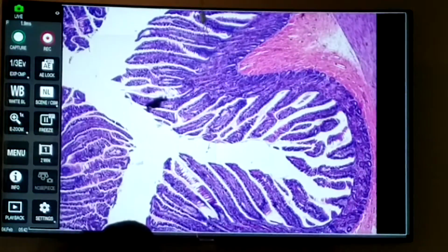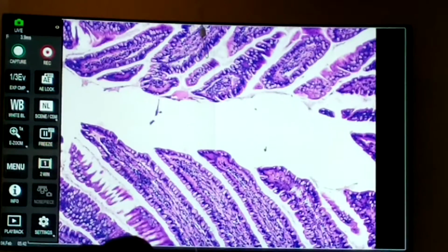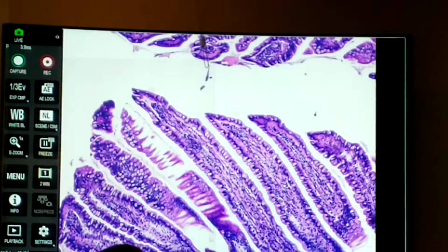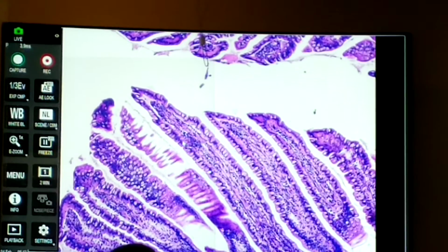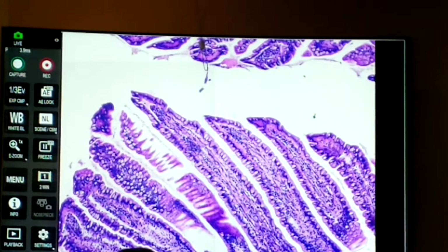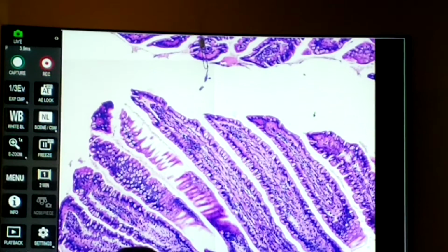Now, sometimes when you're looking at simple columnar epithelia, if you don't look at enough of the slide, some of the cells will be packed upon each other, and you can begin to look at some places like, oh, maybe this is a stratified epithelium. But you have to look at an area where the tissue is cut at a 90-degree angle, so you have perfect alignment of the cells, and then you recognize, well, this is a single layer.